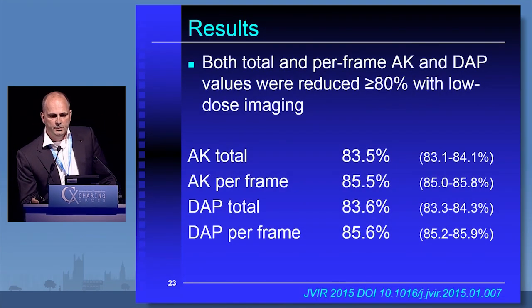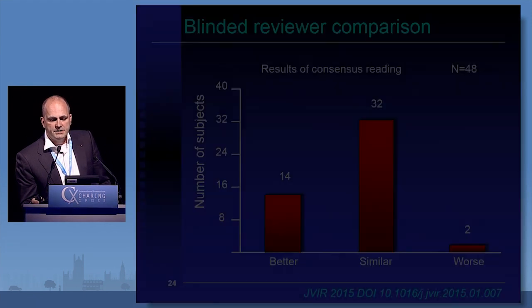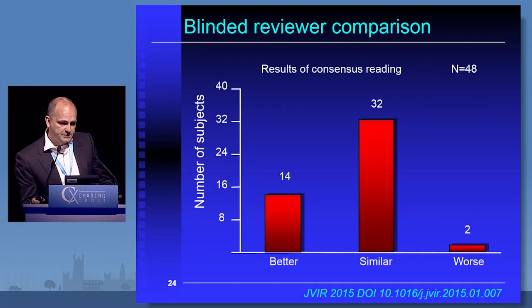What are the results? We compared total and per frame air kerma and dose area product values, and we were able to show that the reduction in radiation dose was well over 80% with this low dose imaging, and these are currently in press.